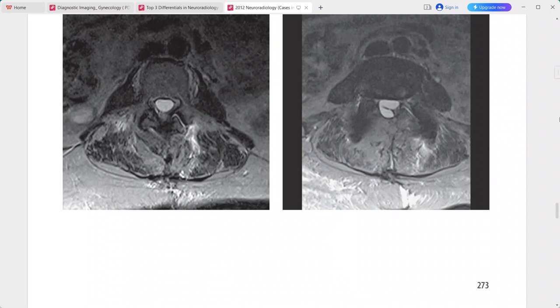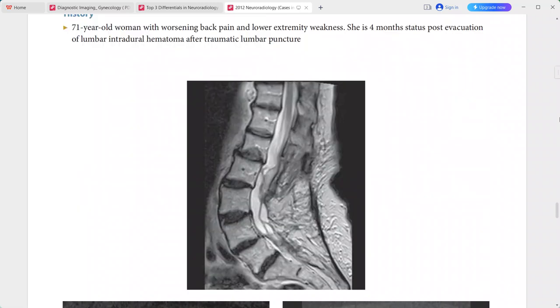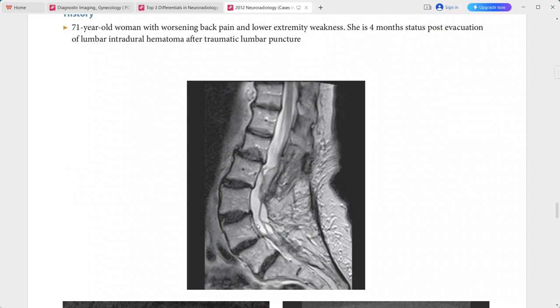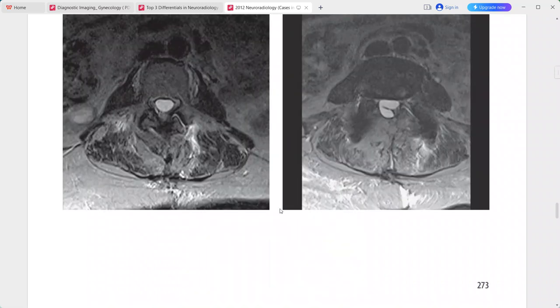The T2-weighted MRI shows an abnormal thecal sac. The nerve roots of the cauda equina are positioned posteriorly and are adherent to the posterior dura. The low signal bands represent adhesions coursing through the thecal sac, creating intradural cysts.